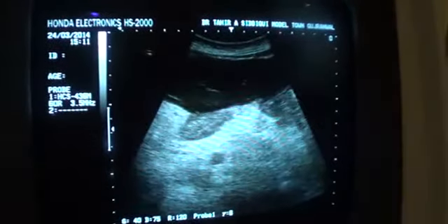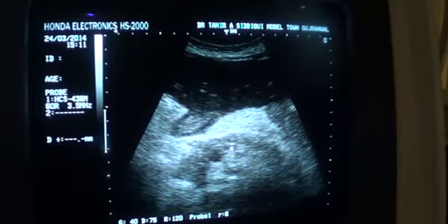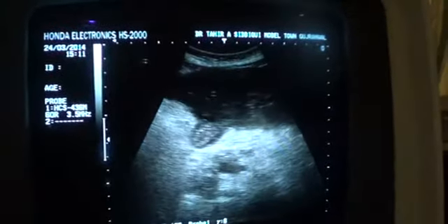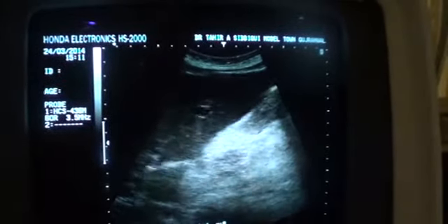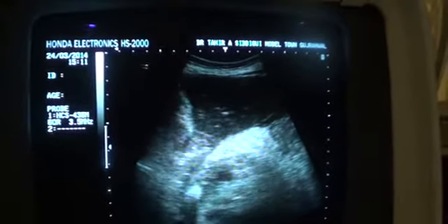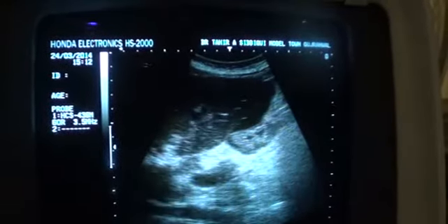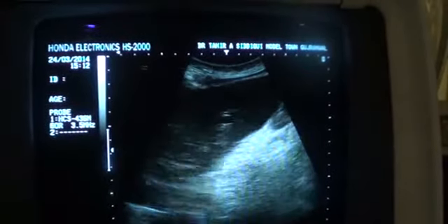So in transverse section, this is the pancreatic duct. In the body region, it measures 3.0, is mildly dilated. However, the pancreas does not show any significant change in its dimensions. No focal mass lesion is seen relating to the pancreas.